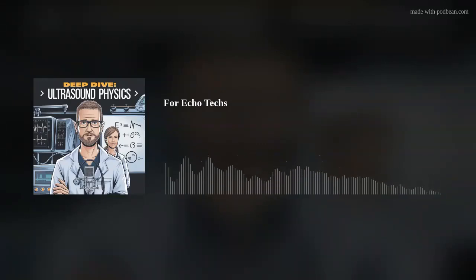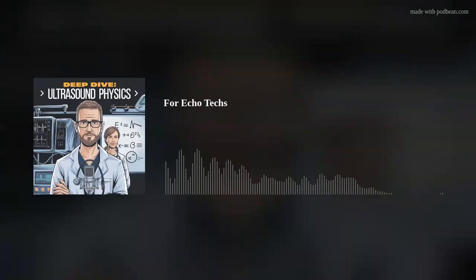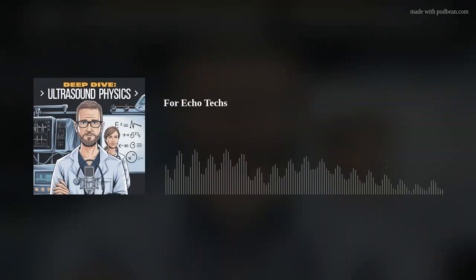You got it. And echocardiography is great at detecting this backflow. We can actually see that turbulent jet of blood leaking back through the valve. It's like a tiny waterfall in the heart. I like that. So the size and direction of that jet tell us how serious the mitral regurgitation is. Yeah, generally a larger jet means a more severe leak. But we also look at how the leaky valve affects the heart chambers.